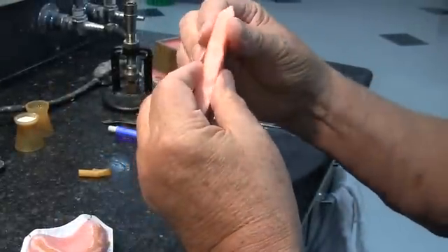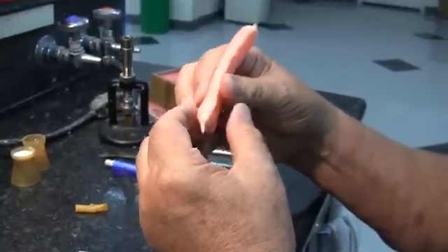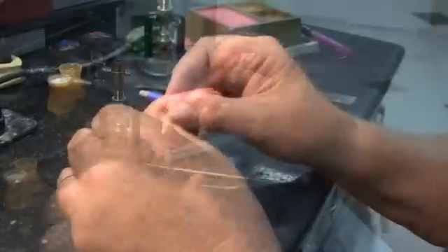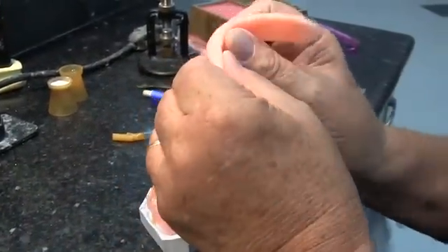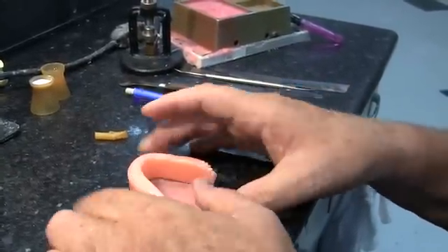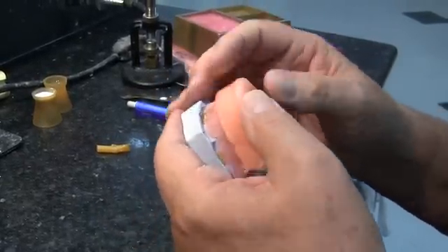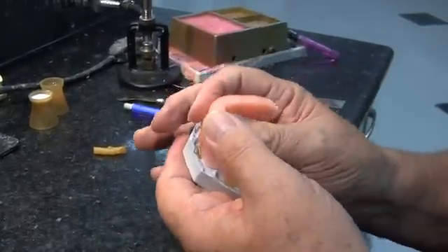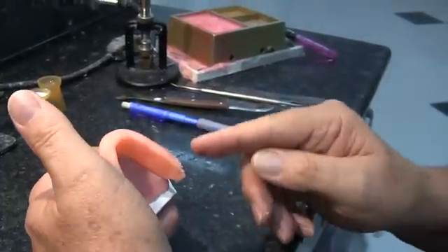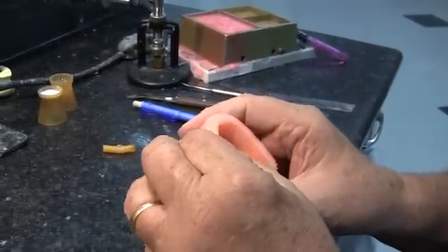Place it on top of the baseplate. The section on top should be approximately 10 millimeters wide, because that's the width we want to end up with. Form it into a horseshoe and place it down on the baseplate, keeping in mind that we want the anterior portion to be approximately 6 millimeters anterior to the middle of the incisive papilla, and the posterior segments to be over the centers of the ridge.